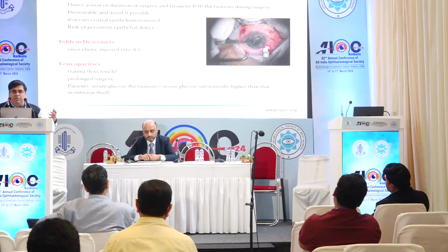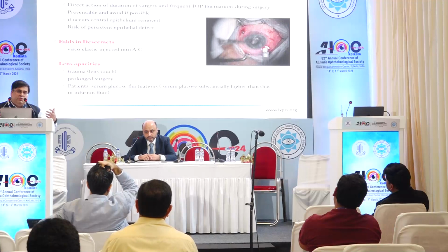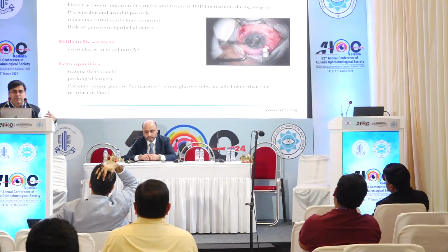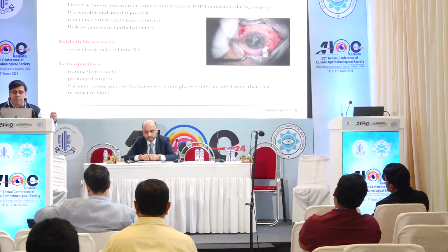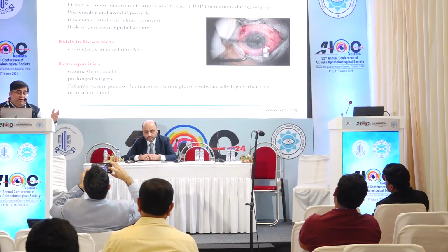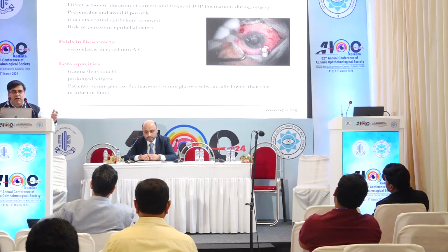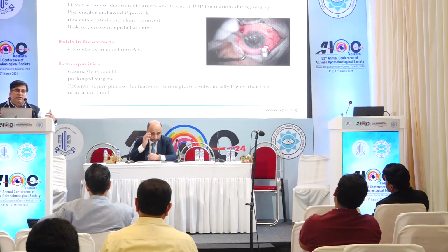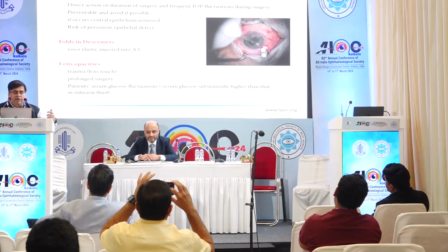This happens directly because of longer duration of surgery and frequent IOP fluctuation. If you keep moving the bottle height up and down during the surgery, that will cause corneal edema, and you can debride the epithelium. I'm a little wary of doing it. I want my surgeries to happen much faster. Why am I scared of it? Because in diabetics, if the anterior segment perfusion is not great, you may risk persistent epithelial defects also.